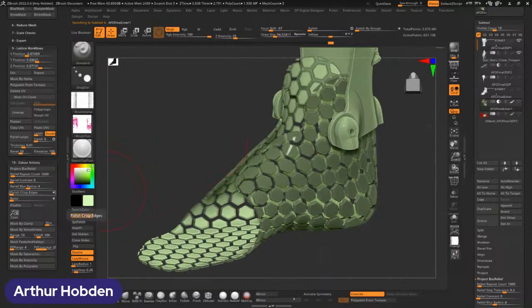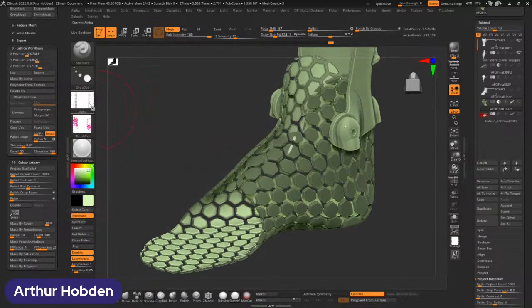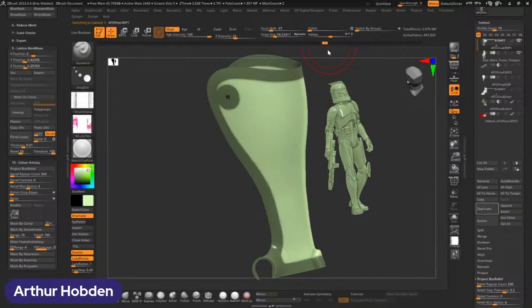Are there any questions about what you can do with ZBrush or what ZBrush is good for or anything else like that? Lewis asks, when you used a black and white picture to do the wrap, can you import without scaling so that you control the dimensions of the pattern? Ooh, potentially. So you can kind of do that. Fundamentally, no, you cannot scale and control things like wall thickness. You just have to sort of do trial and error to figure that out.